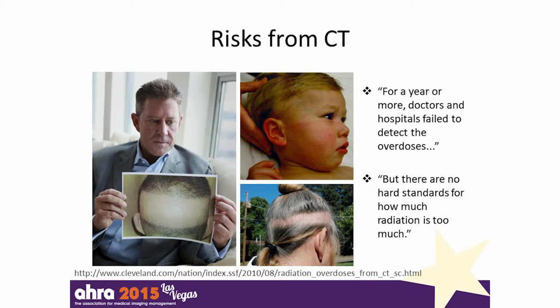The thing that was really concerning when these articles came out a few years ago was not that there were a few isolated cases where the exposure was high enough to cause these effects, but rather that these effects went unnoticed for a year or more because there was no program in place to detect them and correct them. And even once people started to say, we need to do something about this, we need to have some sort of quality assurance program in place, there's no hard standards for how much radiation dose is too much.